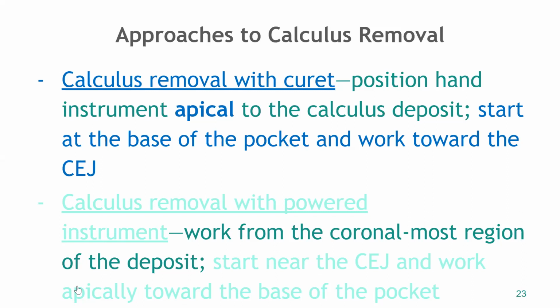Calculus removal with a powered instrument is actually the opposite. We're going to work from the coronalmost region of the deposit. So we're going to start near the CEJ and work apically towards the base of the pocket, okay?